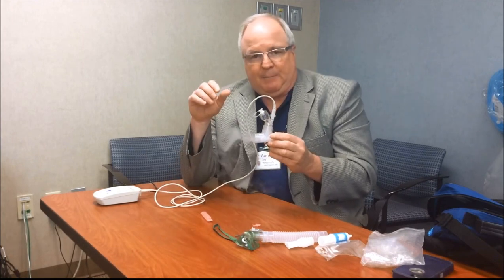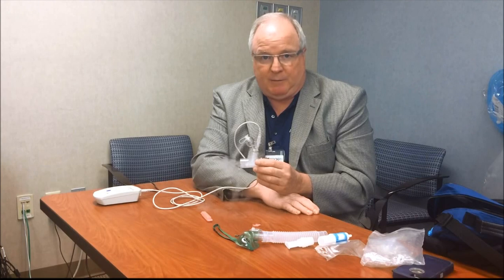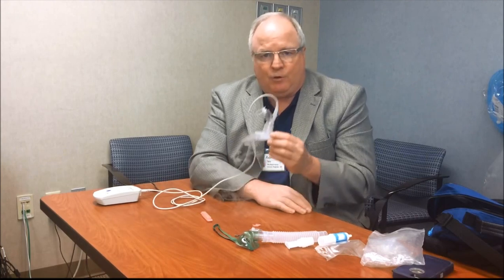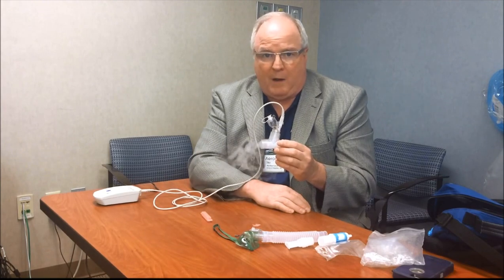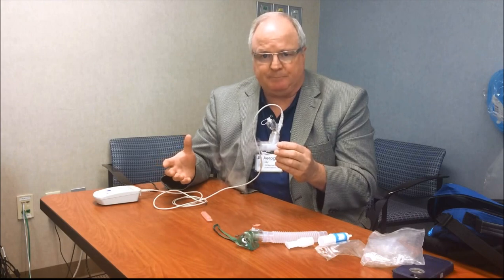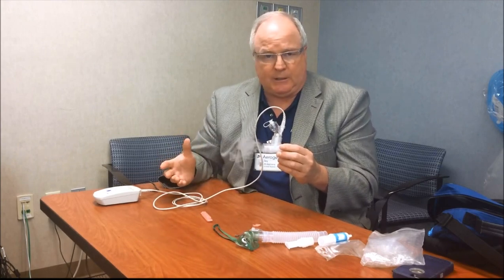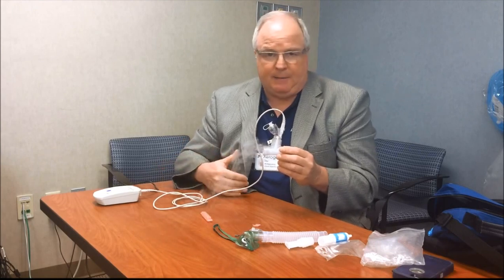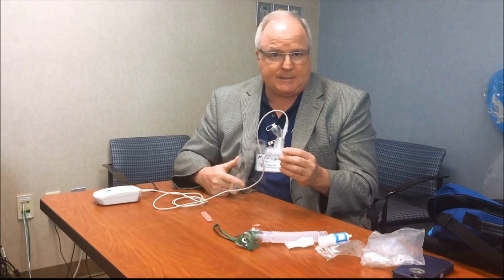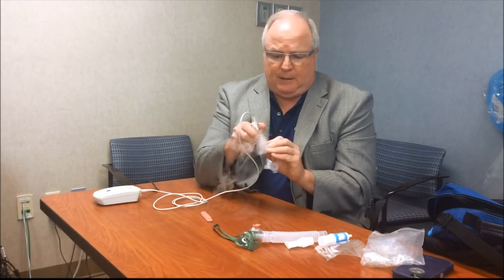One other thing to keep in mind is because it's good for 28 days, many of your patients are going to be on and off a ventilator within 3 to 5 days, I imagine. So you could also use this because it will be pole mounted with a locking bracket and a basket that will have your supplies with it. Once the ventilator is removed from the room for reconditioning and cleaning, the patient may end up in another modality, be it BiPAP, oxygen delivery by mask, or by cannula. You could actually use this in other devices.